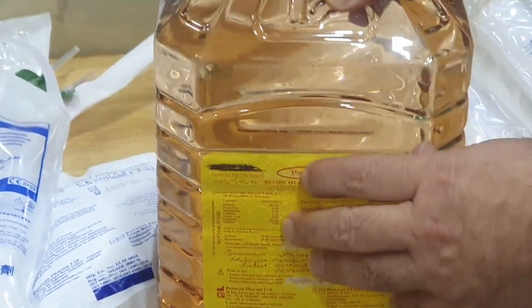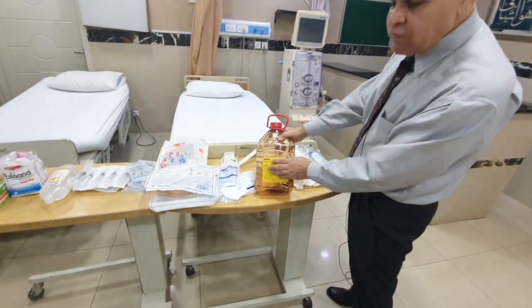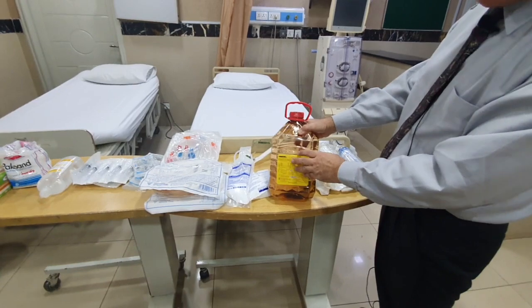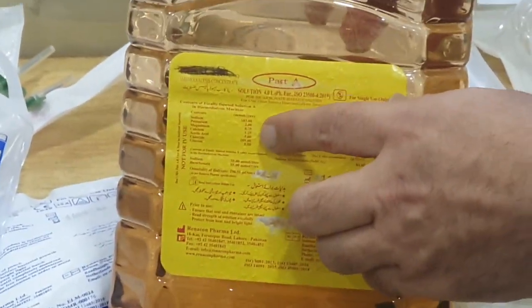But remember, with a low potassium fluid, you will not get a zero potassium, because if you go to zero potassium, by simple diffusion, the body will lose all of its potassium or most of its potassium, and the person can go into arrhythmias. So even with a low potassium fluid, you will have some potassium in it. You can never get a zero potassium fluid, because then obviously that is going to cause cardiac arrhythmias. But a low potassium bath will have less potassium in it.